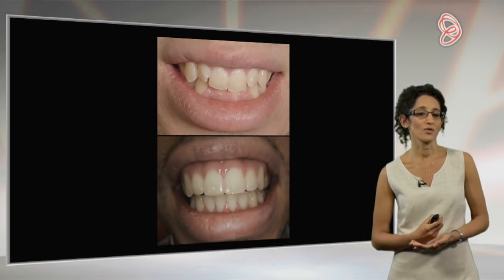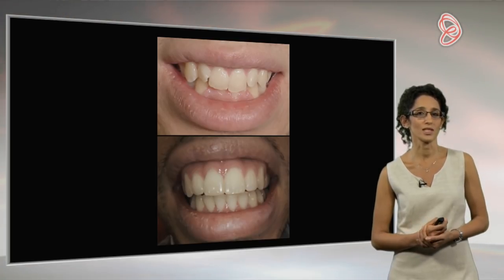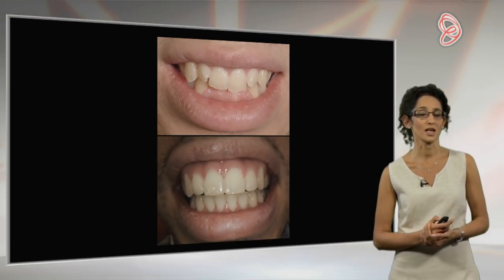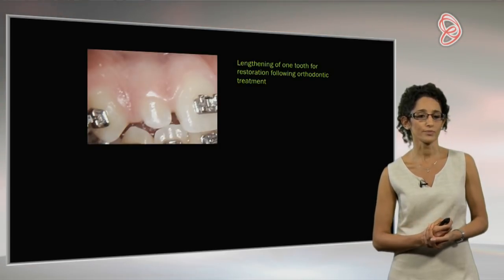You can remind yourself how he looks before, and that's how he looks afterwards. So, happy, smiling, but you can still see the papilla. It's a lovely smile, but none of that thick fibrous tissue. So that's just another example of a more subtle cosmetic case that you don't always need to end up having crowns put on.